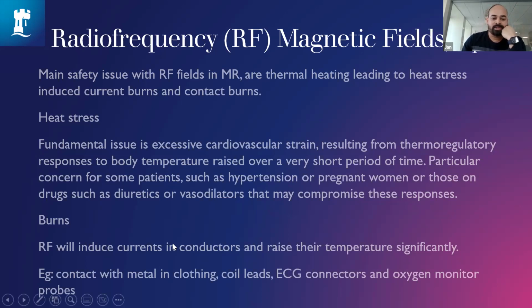The things that we come across in these cases are probes and metal. Usually you have contact with metal in clothing, coil leads, ECG connectors, and oxygen probes that are usually the culprits. In our case, it was the ECG probe that gave us trouble.